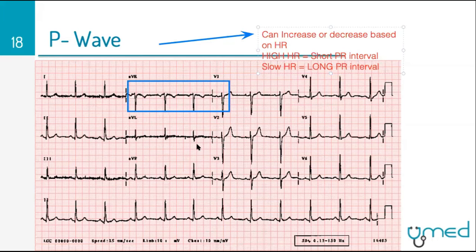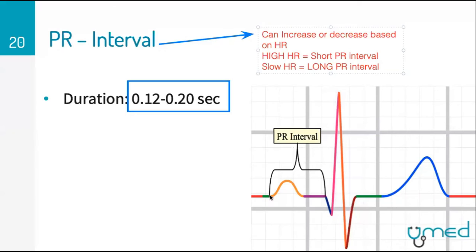They dub it a PR interval to imply that the line stops wherever the QRS starts. So if the QRS starts at an R wave, that's where the PR interval ends. If the QRS complex starts at a Q wave, then that's where you have the PR interval. So it's a misnomer, but it's not a misnomer. Hopefully you guys get that, right? Ryan, you understand that, right? Yeah, I get it. Okay, good.